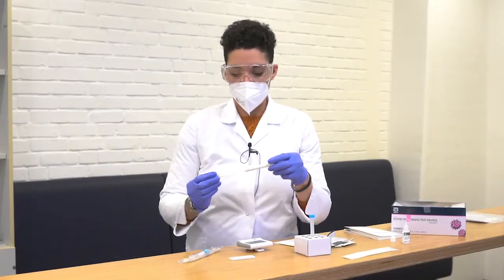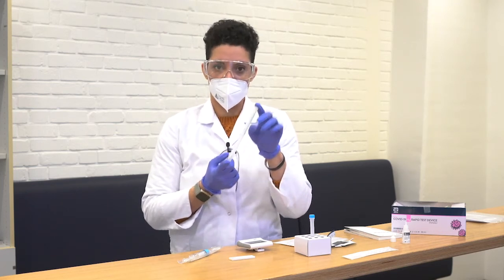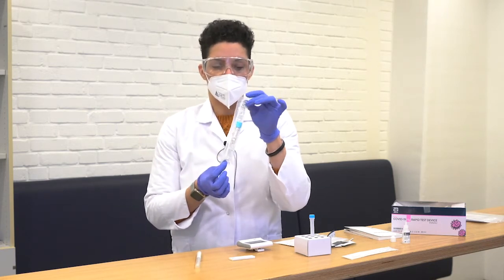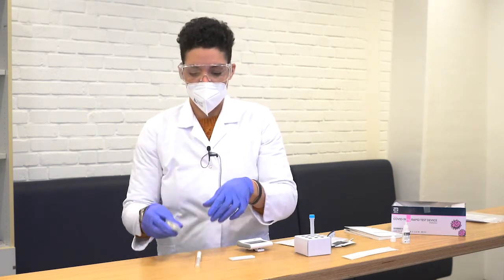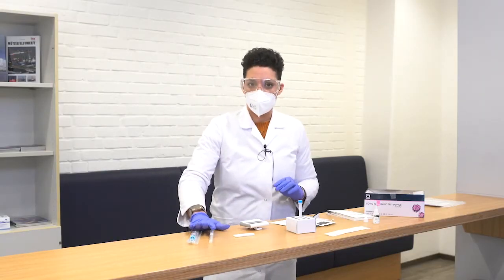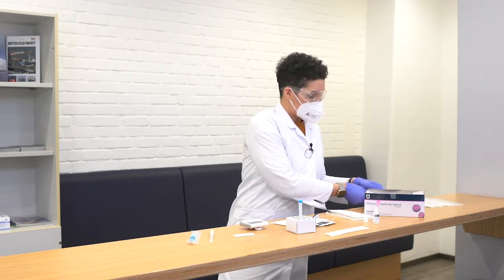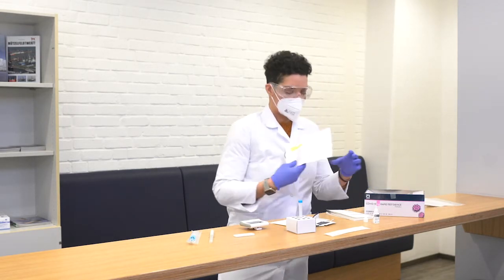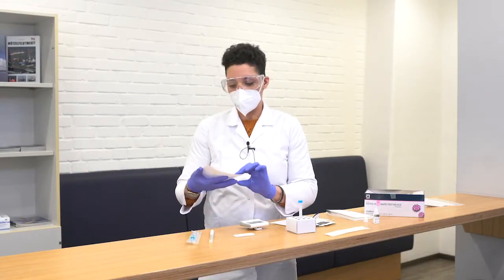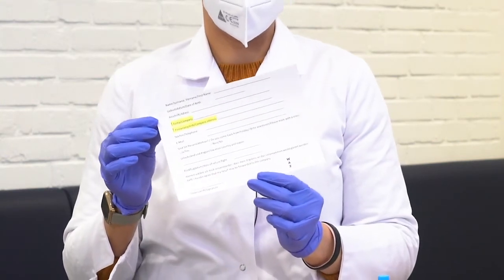So there's going to be 2 ways that you're going to get the tube for the actual PCR test. It can look like this, or it can look like this. There's really no real difference in the way that you're going to have to use it. So you proceed with these just as we have just shown outside. Also, what you're going to get with these PCR tests is a sheet of paper with questions in German and in English. For example, your name and your phone number, email address. Please fill everything out to the best of your knowledge.